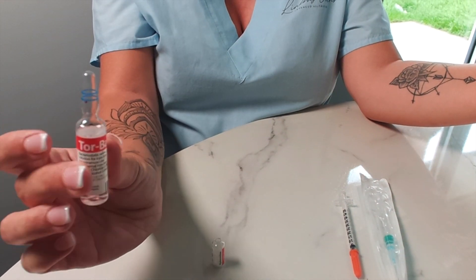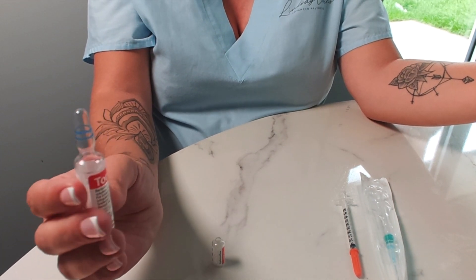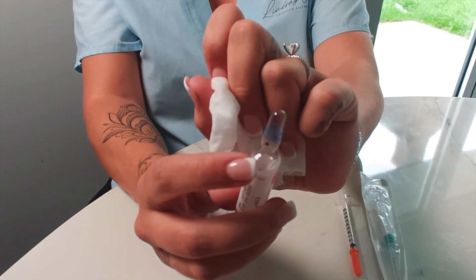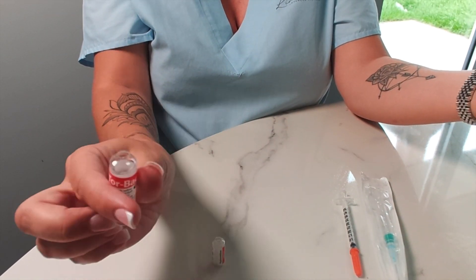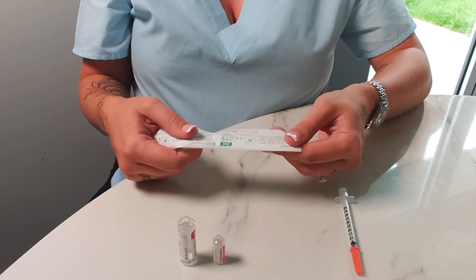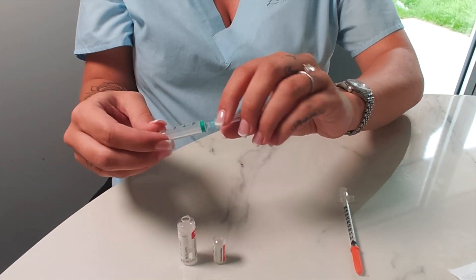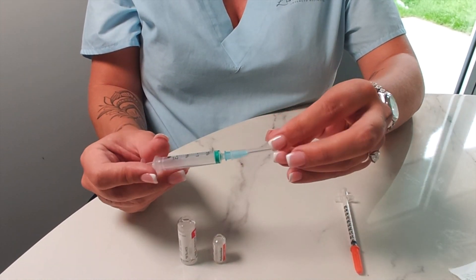This is a 5ml bottle. In case of an emergency I use 1ml; if I'm doing elective dissolving I mix it with 2ml, so a 5ml ampoule is more than enough. Place your thumb where the dot is and snap away for a clean break. Next, open your 2ml syringe. If the syringe and needle come separately you can buy them individually, but I like to buy them together.